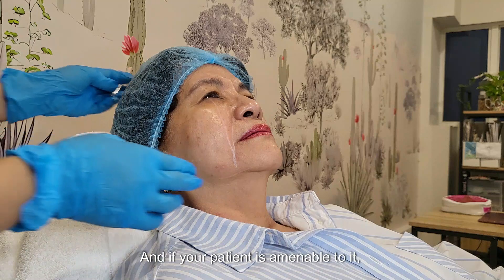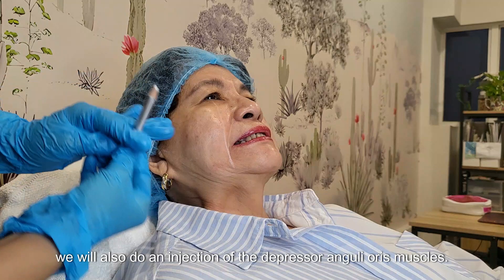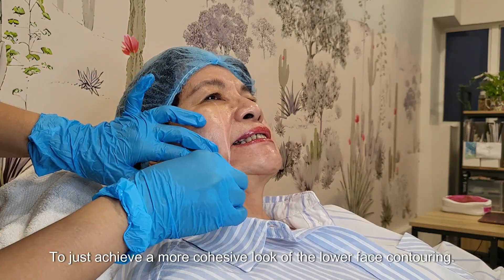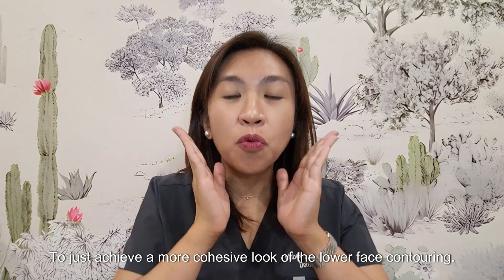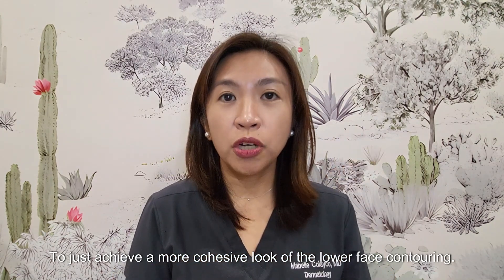And if your patient is amenable to it, we will also do an injection of the depressor angularis here to achieve a more cohesive look of the lower face contouring.